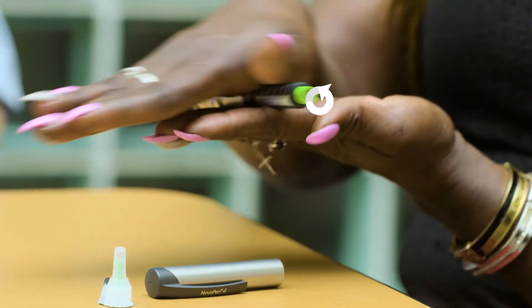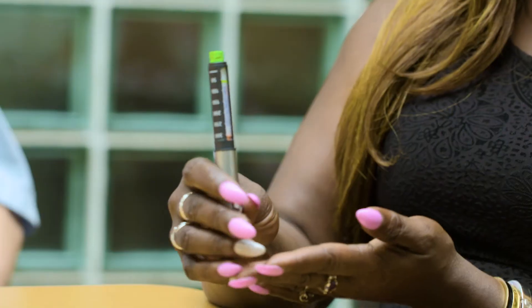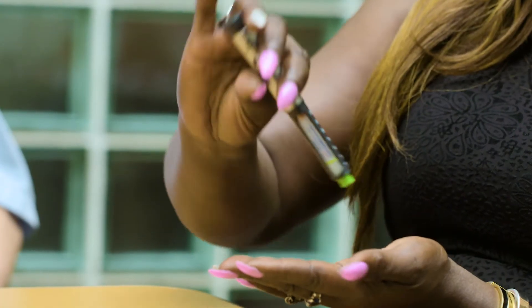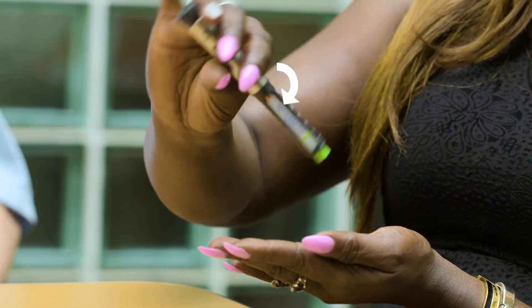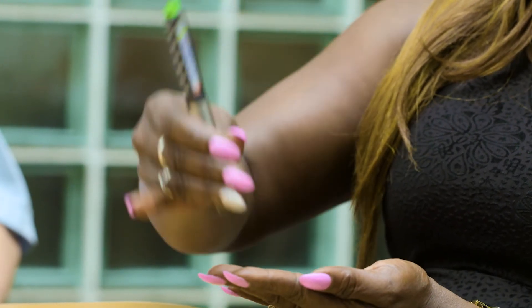Don't ever shake the insulin. To mix the insulin, just roll it between your hands horizontally 10 times. And then gently tip it 10 times to make sure that it's milky white.